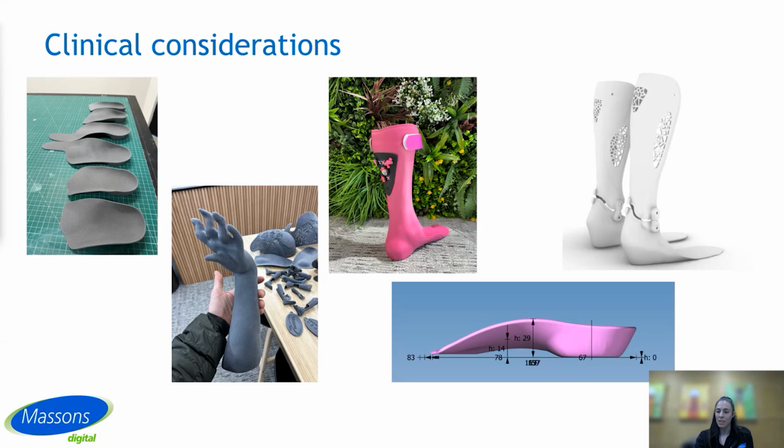And with limited information on performance and durability with higher end orthotic componentry, it's difficult to know how the 3D printed devices compare to those traditionally made. Saying that, since we've started introducing them into our own clinical practice, we've made significant advances in both our design and our manufacturing journey, with more complicated and more advanced products being produced with really great trial success.